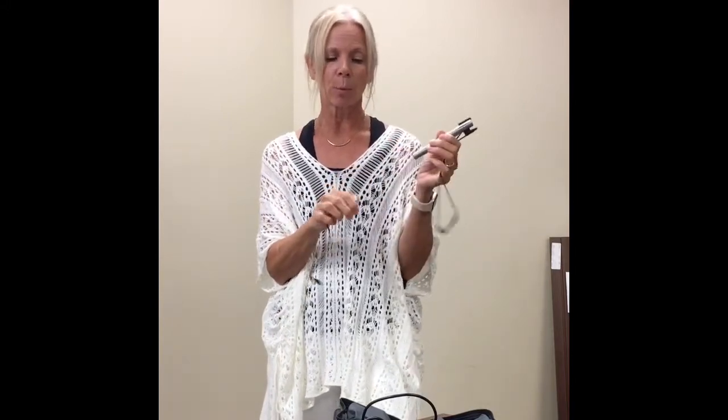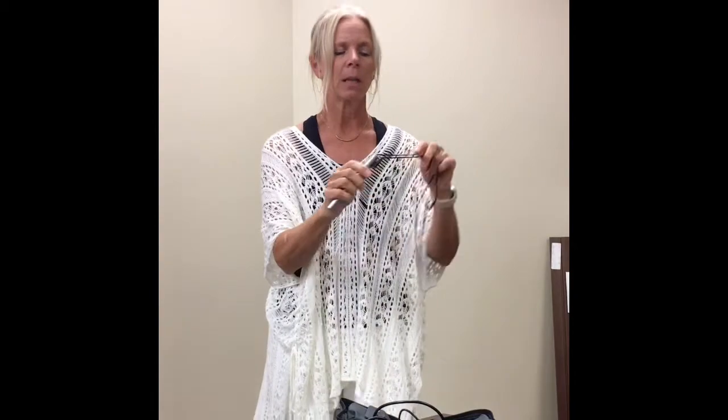Something else that's really important to remember as a teacher is during times of discussion in the classroom, when students are asking questions and conversations are happening, your student with hearing loss is only going to be hearing what is coming through the microphone in the majority. They do still hear sounds and people talking around them, but it is not as clear. This is going to be louder than that information.